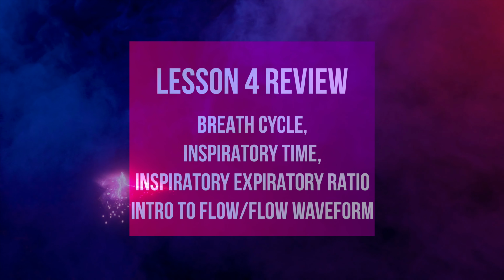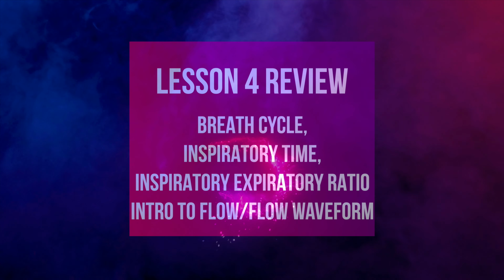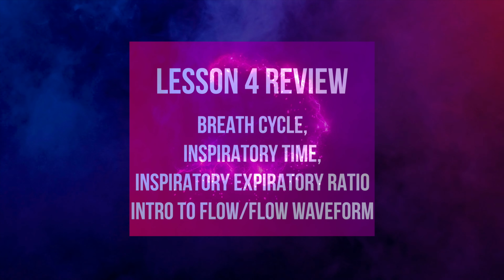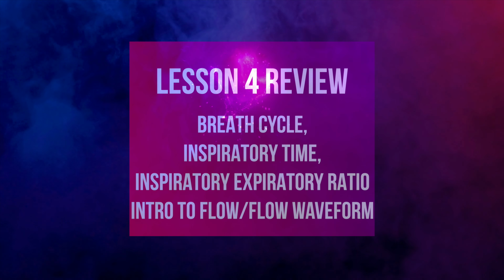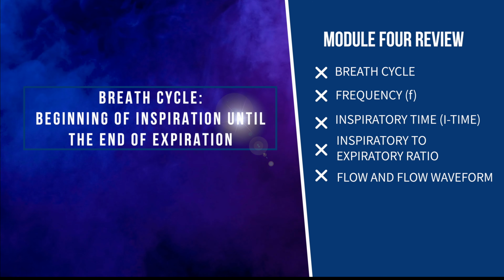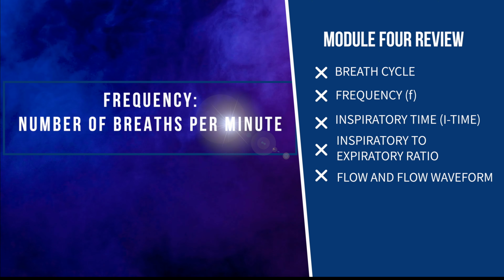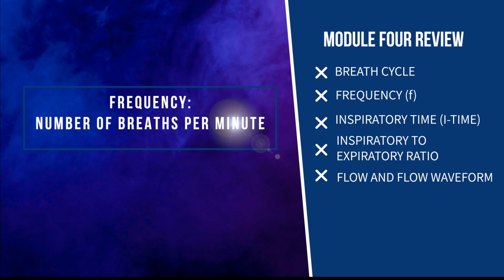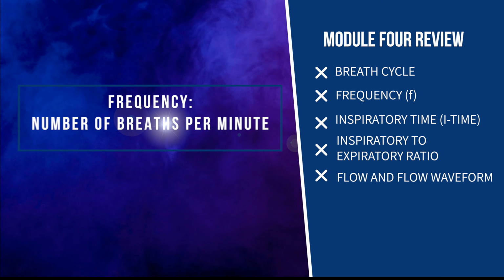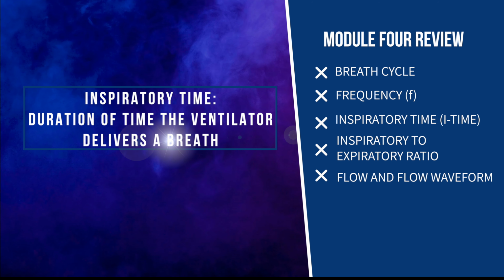Before we proceed, let's recap the key points from our previous lesson. We explored the breath cycle, inspiratory time, and inspiratory to expiratory ratio, and introduced the flow waveform. These concepts help form the foundation of our understanding of mechanical ventilation. The breath cycle initiates with the start of inspiration and concludes with the end of expiration. The ventilator delivers a specific number of breaths per minute, known as the frequency. The time in seconds when the ventilator delivers a complete breath is the inspiratory time, or I time.